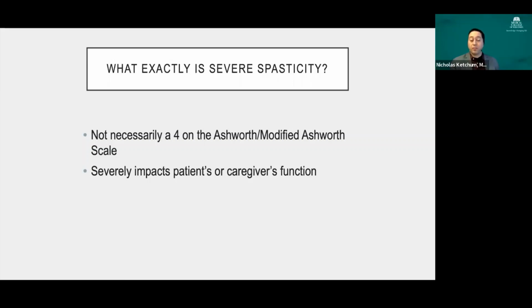And so even though she had what I would consider maybe moderate spasticity in one limb, she elected to have a baclofen pump. And it really got rid of those ups and downs in her function, because she was getting steady control of her spasticity continuously, rather than having to wait every 3 months for neurotoxin injections.